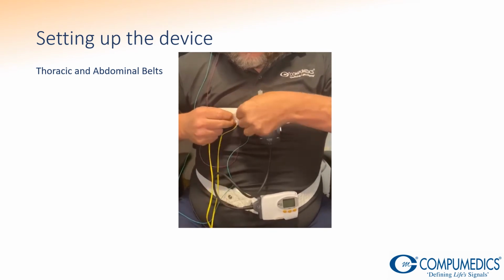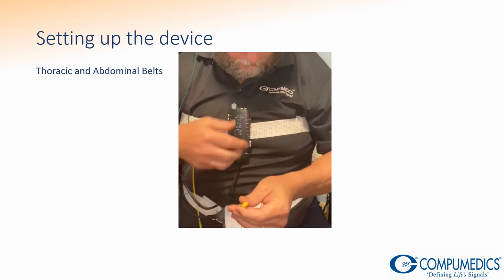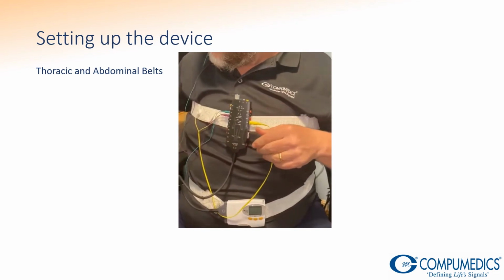Again, we recommend a snug and firm fit, but please do not over-tighten or make it feel uncomfortable. The bands do need to stretch to show us how deep you are breathing.